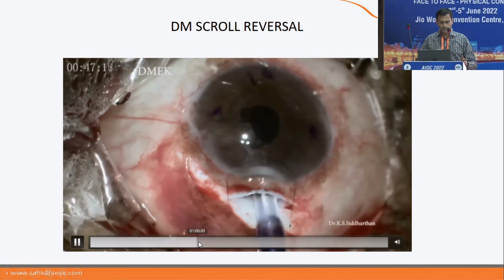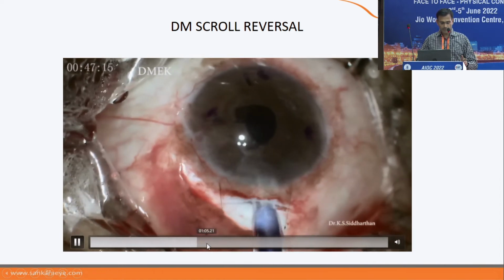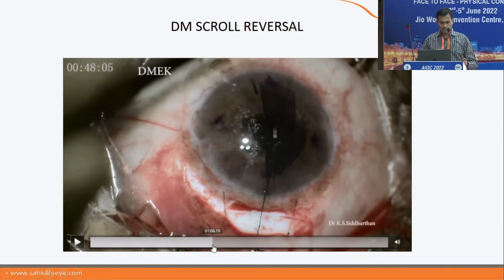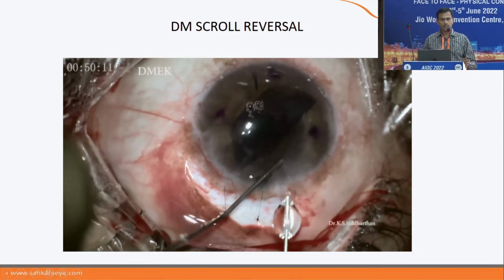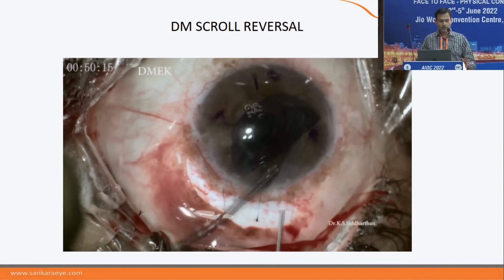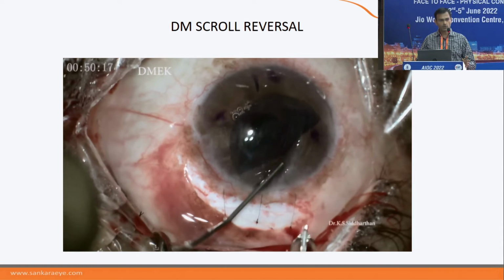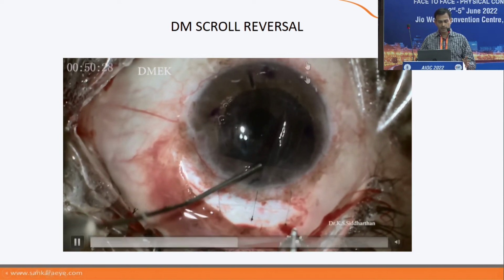I'm removing it. I've done an iris claw, and after that I am putting a suture, 3 sutures, and then here what I want to show is, I'm trying to unfold here, and it unfolds. But you can keep seeing, I don't know whether you can see, it's unfolded the wrong way. It's unfolded the wrong way. I'm doing the same technique, and you can see that the L mark is on the opposite.